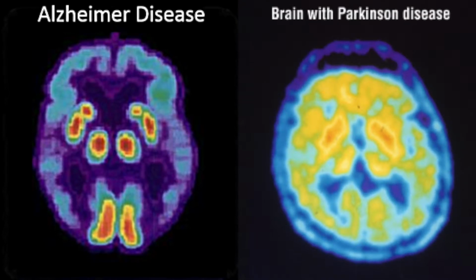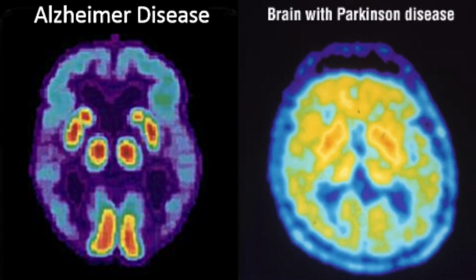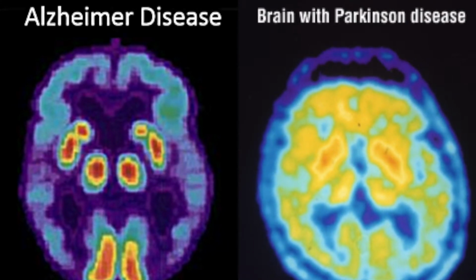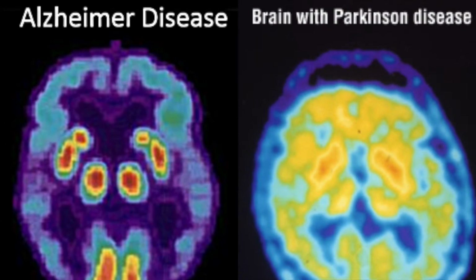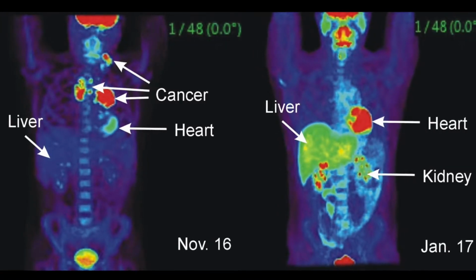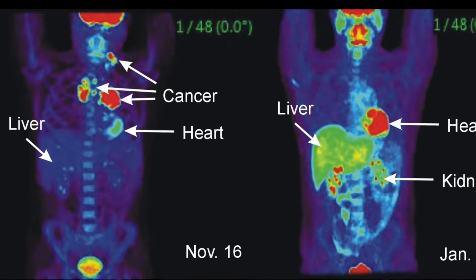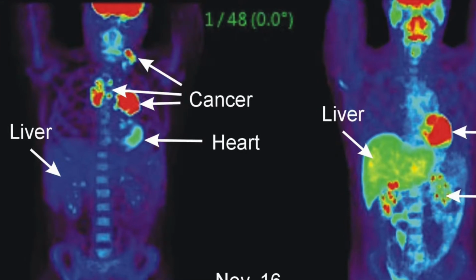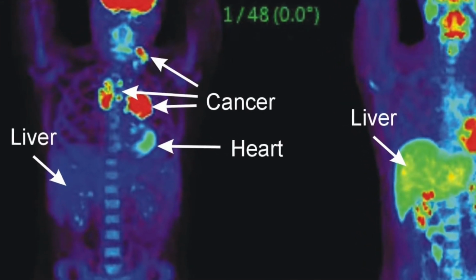One of the main reasons for using it is to help diagnose diseases, for example Alzheimer's, Parkinson's, epilepsy, and Huntington's disease, or to detect a blood clot and bleeding diffusion within the brain. During many research phases, it was concluded that the PET scanner could also detect the spreading of cancer. This allowed the treatment for cancer to start early while reducing several risk factors in the near future.